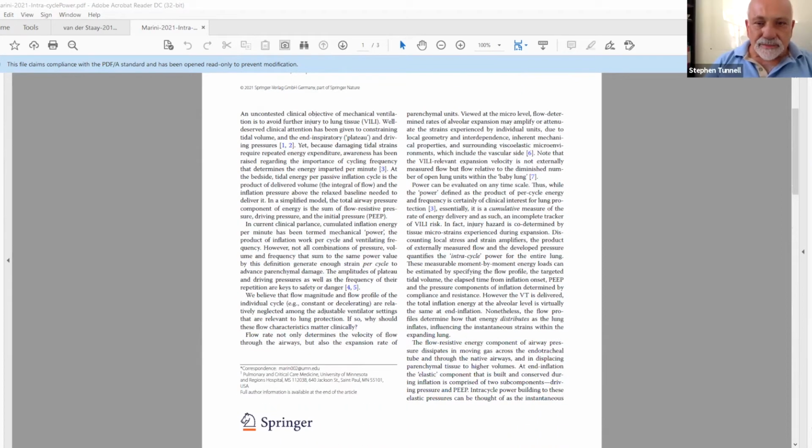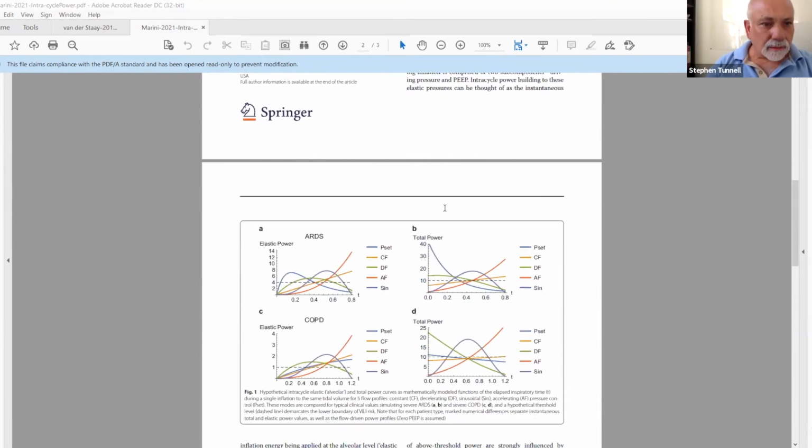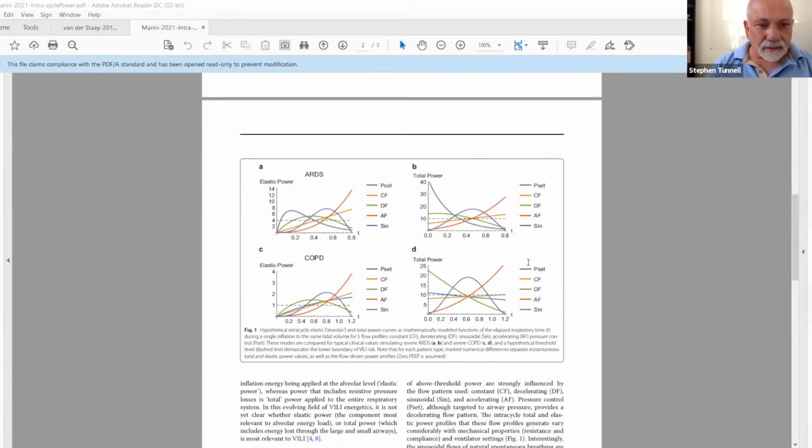Yeah, on that previous paper, they had raised this theoretical threshold as well, and they had presented it in relationship to a volume-based breath. So it seems like they're progressing. They're evolving. They realize that there are other ways to ventilate people. Yep.